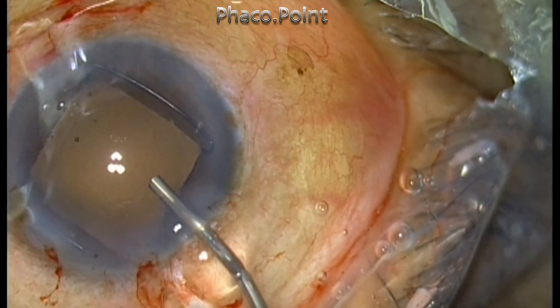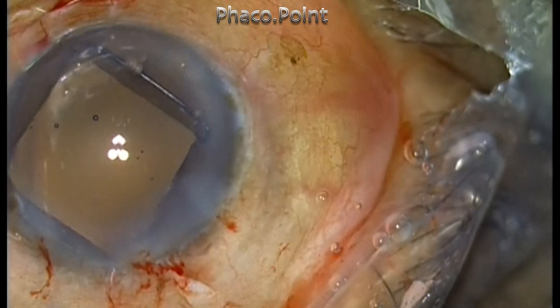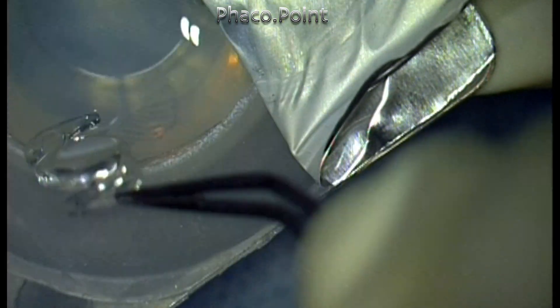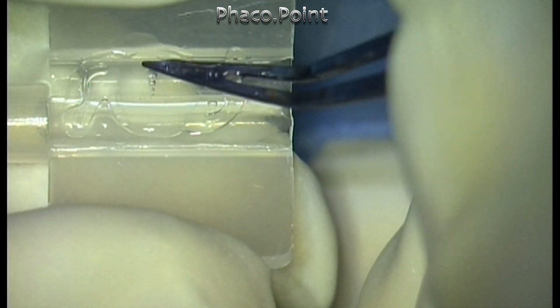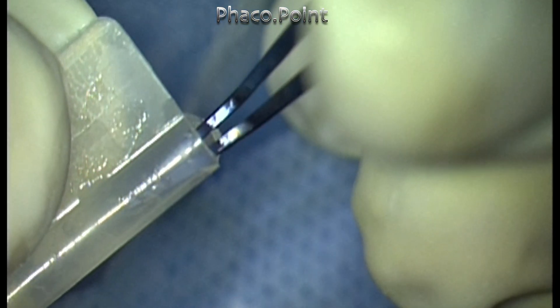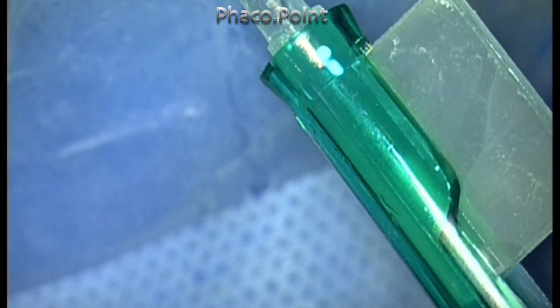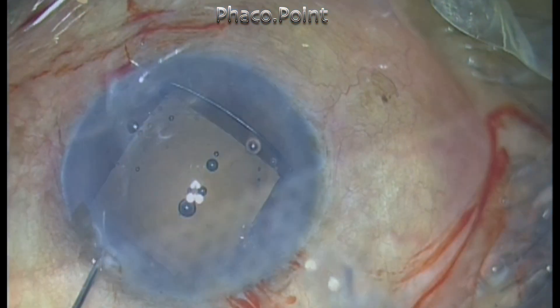In this case I'm not going to give my OT assistant a second chance to load the IOL — I take it upon myself. The butterfly cartridge is primed with viscoelastic and the IOL is loaded carefully inside the cartridge. I tuck the trailing haptic over the optic of the lens, confirm the tuck is good, and perform the push test — retracting the plunger to make sure the IOL is completely free from it. Only after all these adjustments do I proceed to inject the IOL.